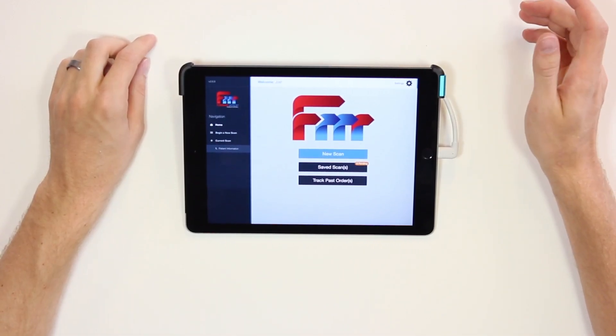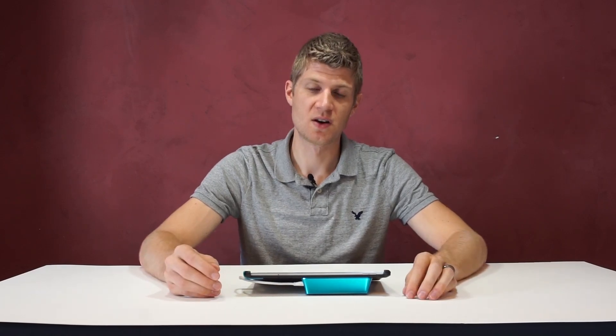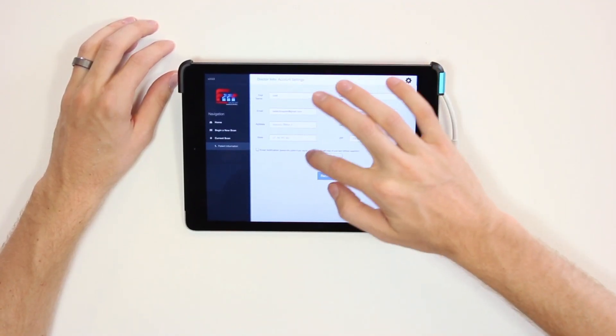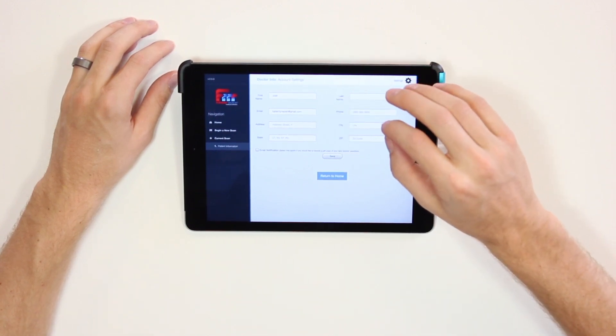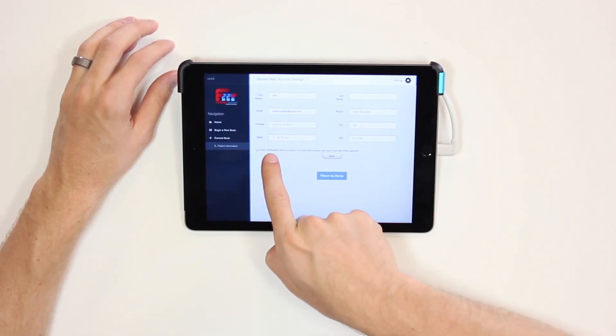Going back to the homepage, just a couple more things. The settings button has two options. Reset profile will delete all scans — be careful, because it will delete all saved scans including stuff we have not yet received at the lab. It's there if you're switching iPads or a different doctor will be using it. The edit profile button is how you'll put in your shipping address, phone number, and other information you want us to have. This information is printed on every prescription form, so make sure it's accurate. There's also a checkbox for email notification of the prescription form — if you check it, you'll receive a filled-out PDF to your email for your records, which you can print or attach digitally.